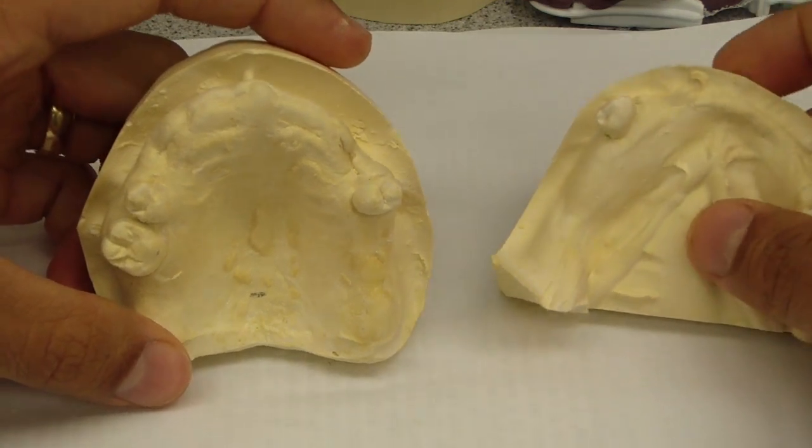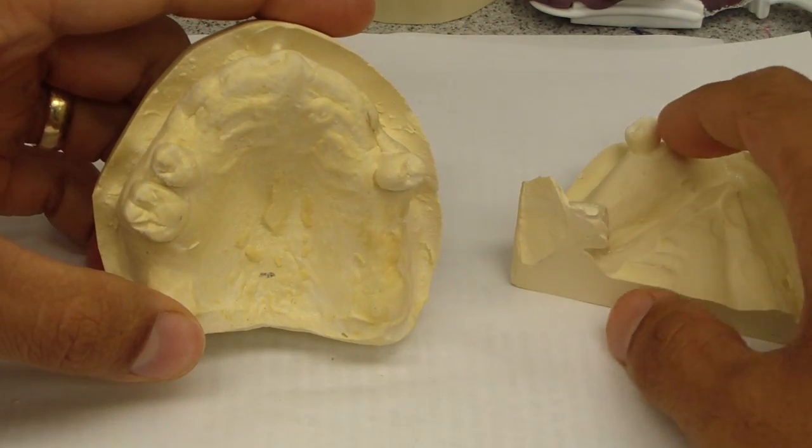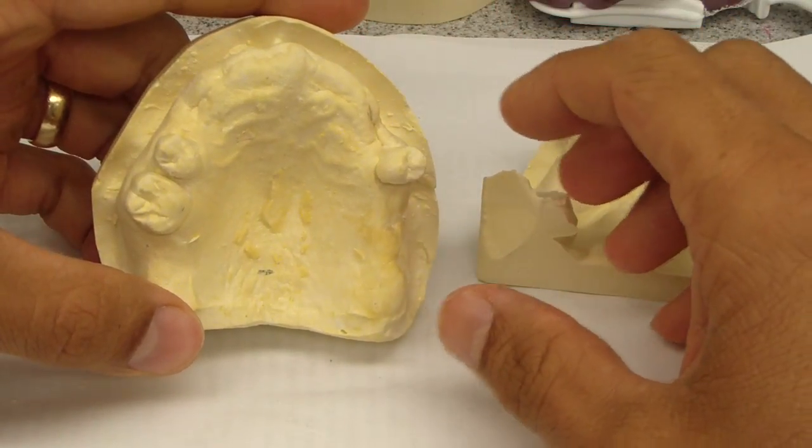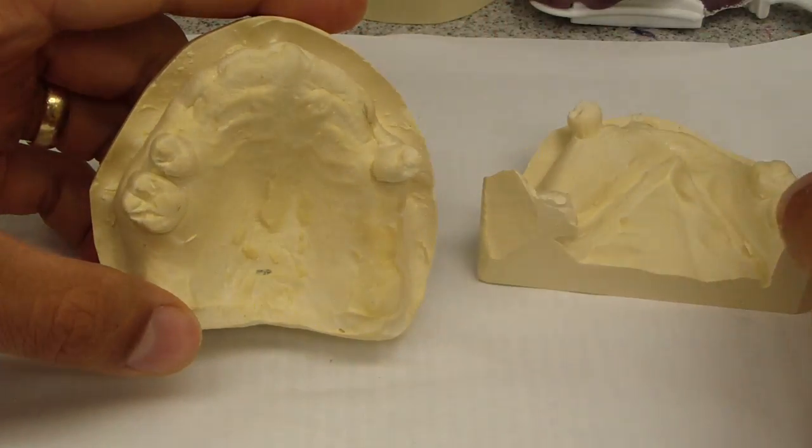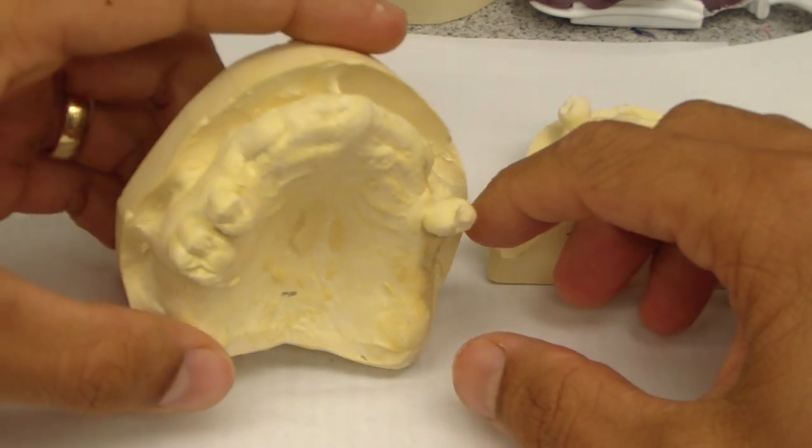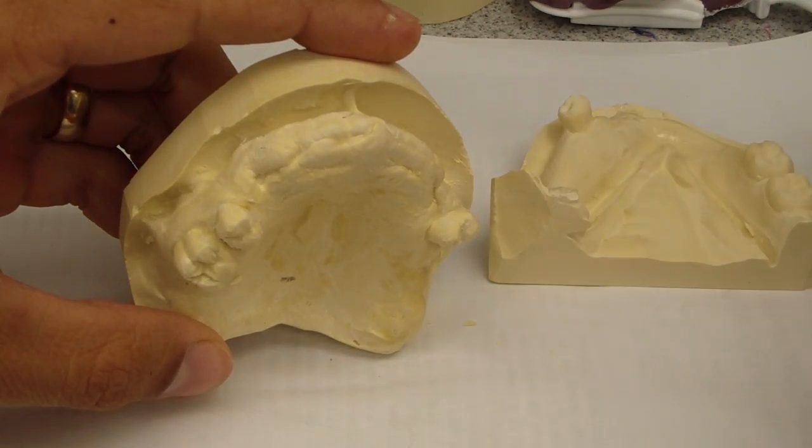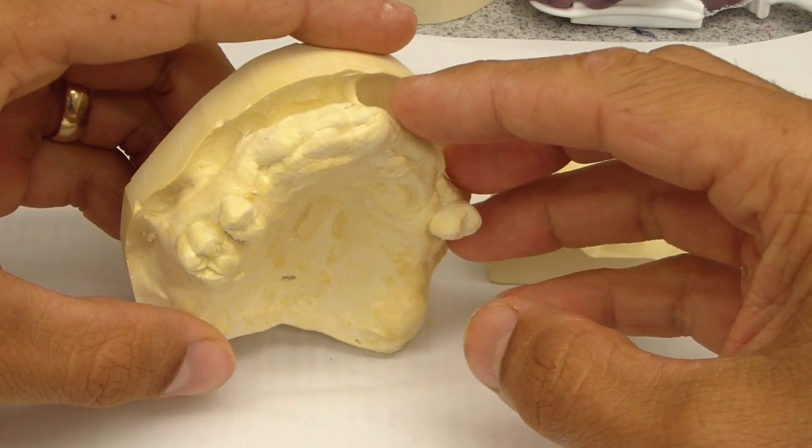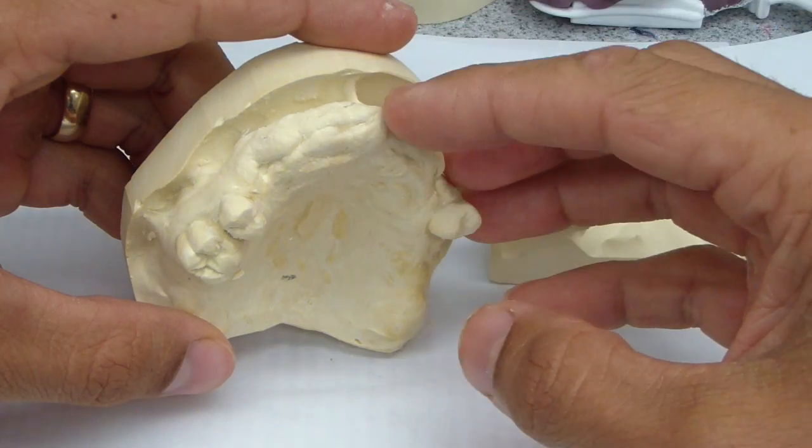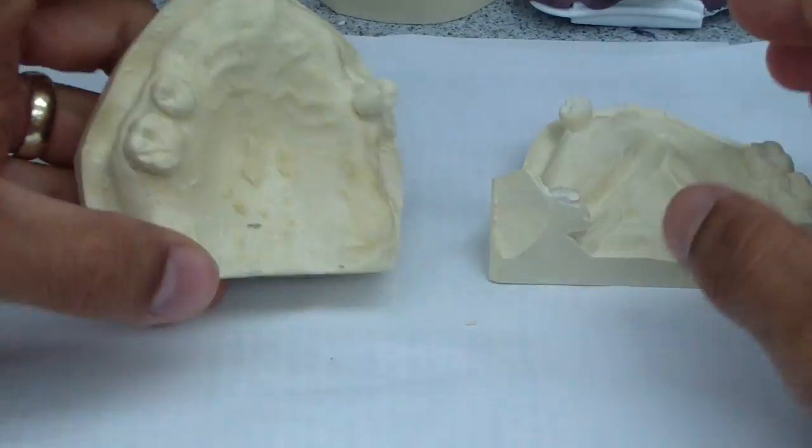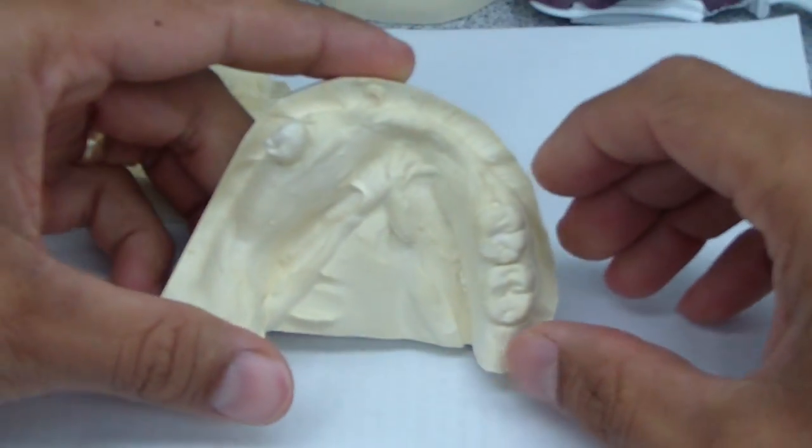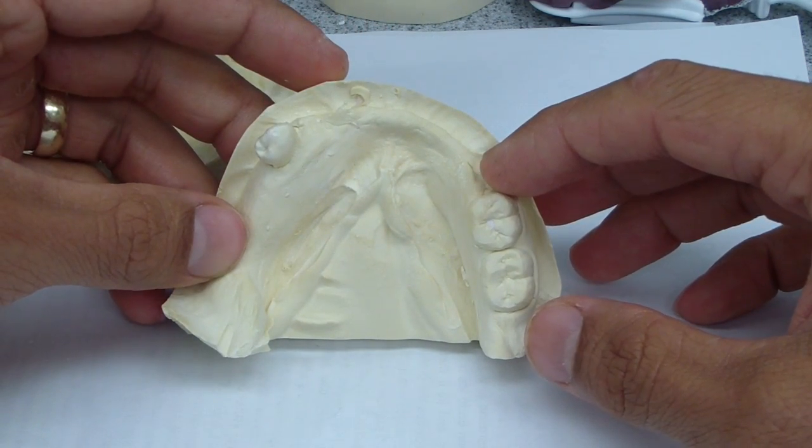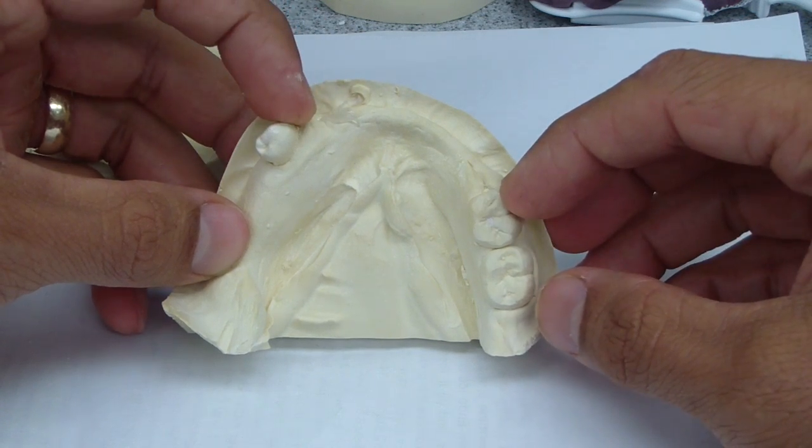So we have in this patient, there's a few videos up discussing the extraction. We extracted a number of maxillary anterior and mandibular anterior teeth, and we're going down the road right now. The treatment plan is subtly changing with time to continue going towards an immediate complete maxillary denture. On the mandible we've taken a look to see the periodontal and pulpal status of these remaining teeth.